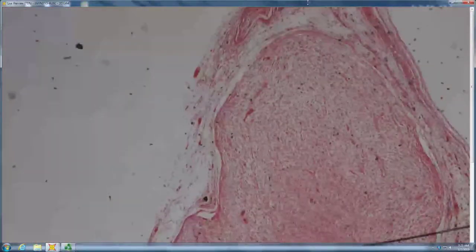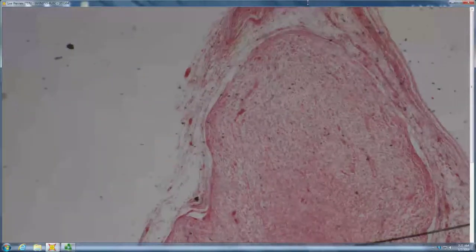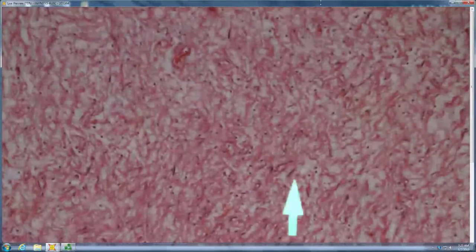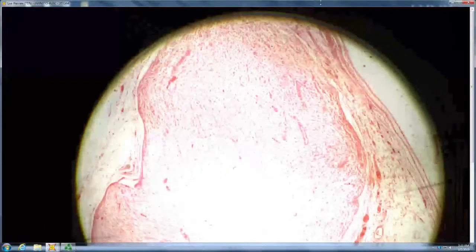It's definitely arising out of a nerve. And when you look at it, the whole nerve seems to have exploded like a piece of popcorn in a popcorn popper and become this big, relatively uniform, diffuse thing. So that's more likely intraneural neurofibroma.